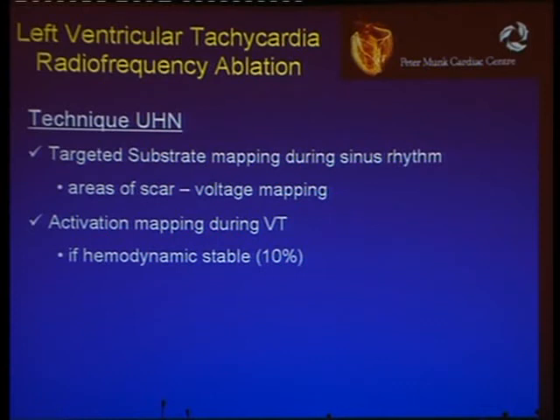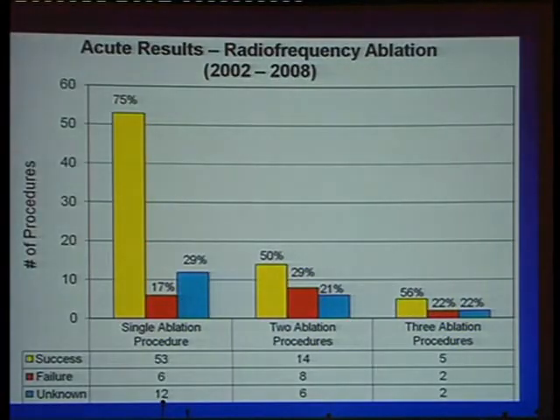So there's a high likelihood of patients ending up in shock during the end of the procedure. If, by contrast, you really do the approaches during ventricular pacing, it's a very relaxed procedure that you can sort of take lots of time to identify potentially areas of interest and then take them out of the equation. And when you're done, you go back in and again repeat an induction to see what you have, whether you removed it.